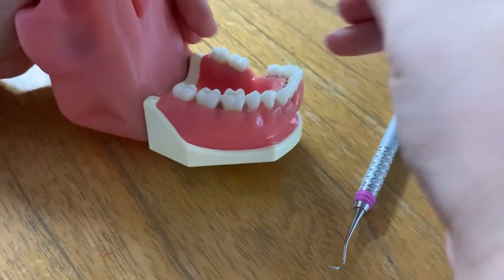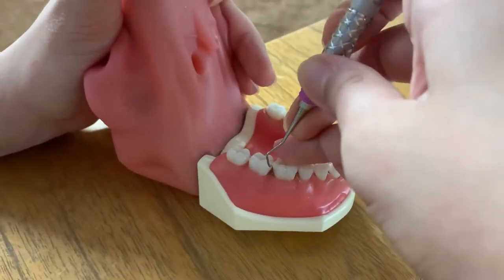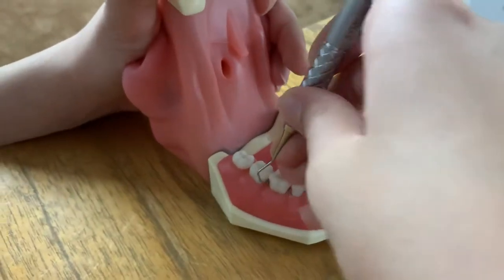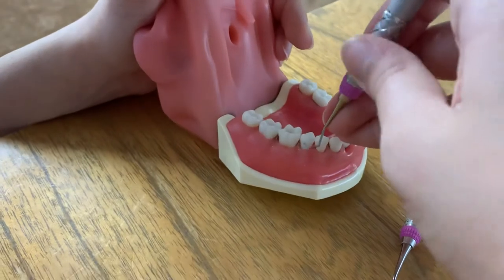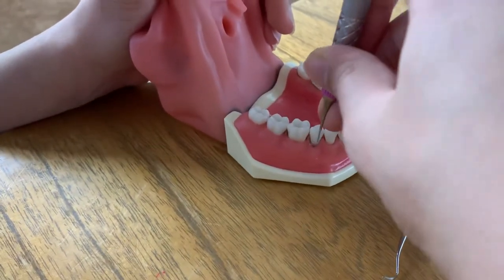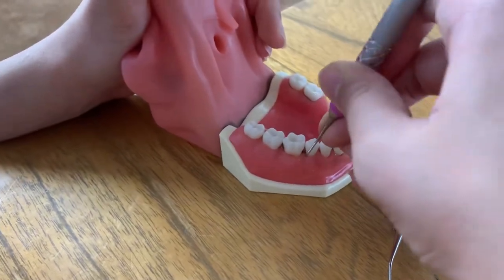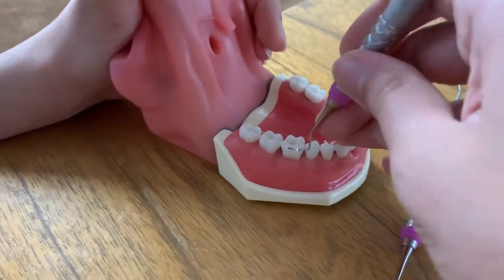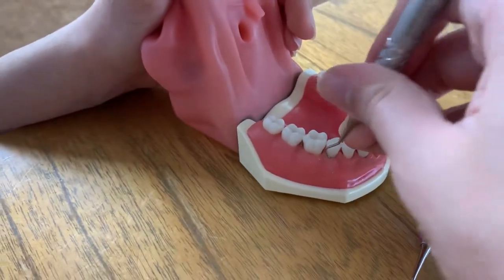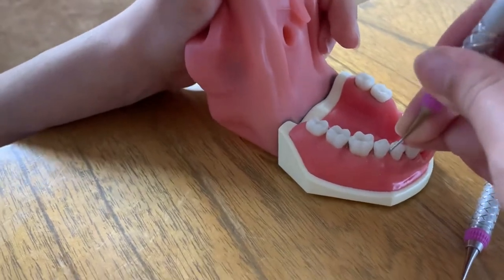Same thing for this tooth right over here. I'm going to flip it over for this quadrant. We're going to practice proper fulcrum and insert with the V to the D. We're going to insert, open, activate with the toe third of the instrument, fulcrum, and rocking. Then I'm going to work mesially just like that, and end up interproximally.